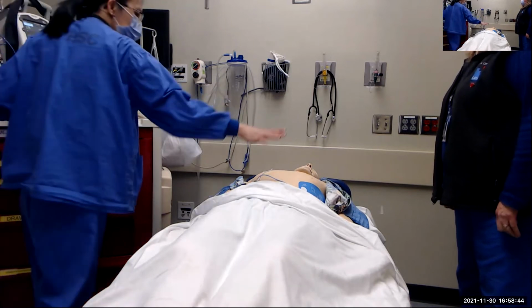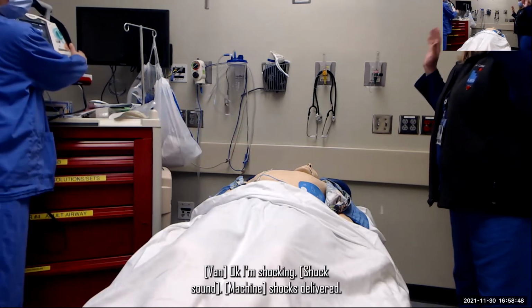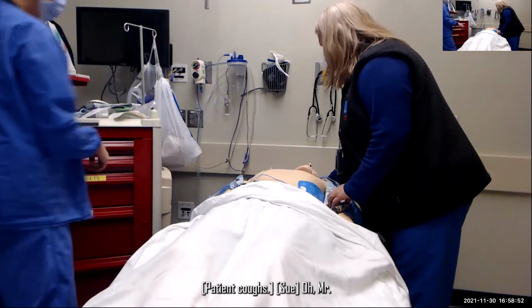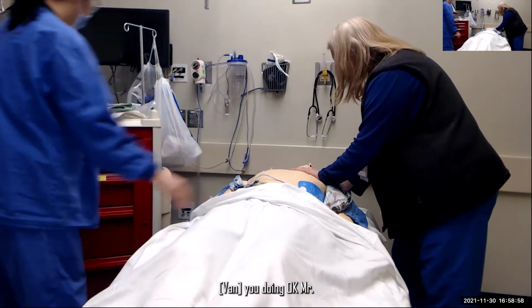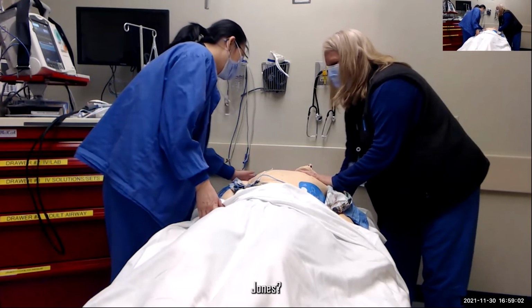So everybody clear of patient. Clear. I'm now delivering shock. Shock delivered. Okay, resume CPR. Okay, Mr. Jones. You doing okay, Mr. Jones? Here, let's go ahead.